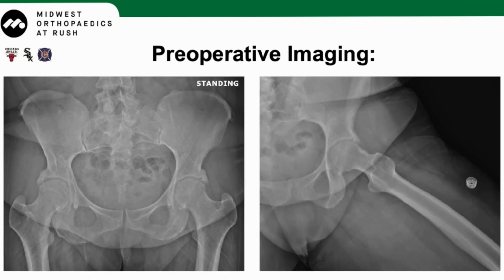Radiographs demonstrate labral calcification as well as a well-preserved joint space with overall Tönnis grade 0 or 1 changes. On the left, the lateral center edge angle measured 50 degrees, consistent with a pincer deformity. The alpha angle measured 63 degrees, consistent with a cam deformity.